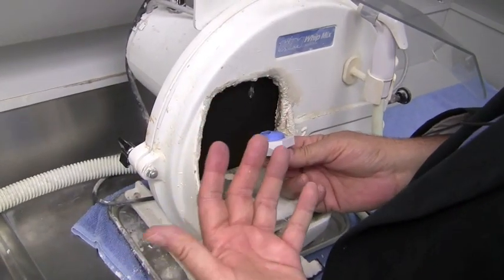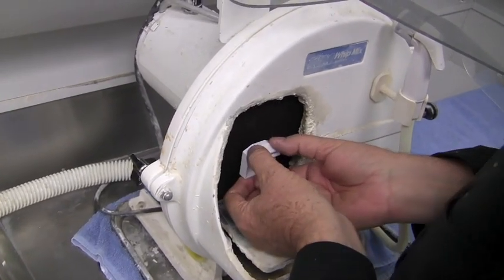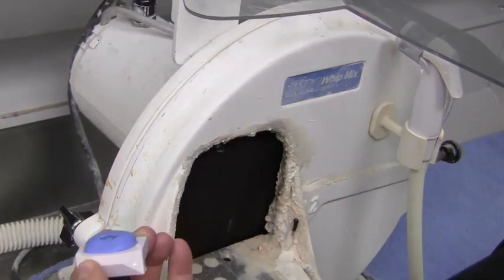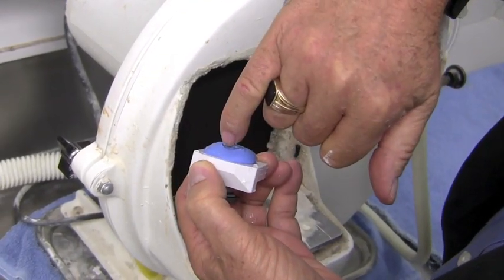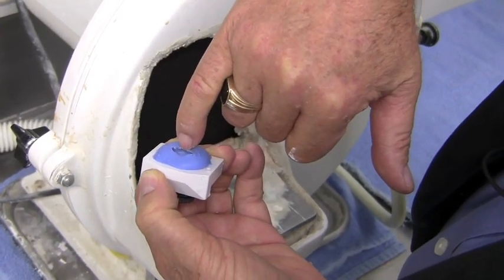I like to use the model grinder for this because it's quick and easy. If you prefer to use your acrylic burr for this, that's fine. I'm just going to come in here and take down this little bit of wall — just like that, quick and easy, done. We can still see that we have that point down there where this vertical shelf meets the part where our stop is for our pin when we go into straight protrusion.